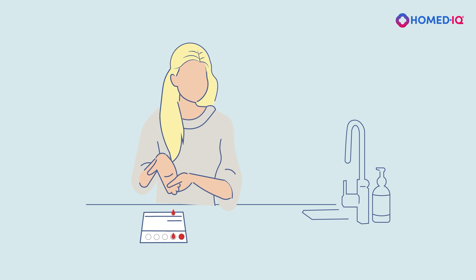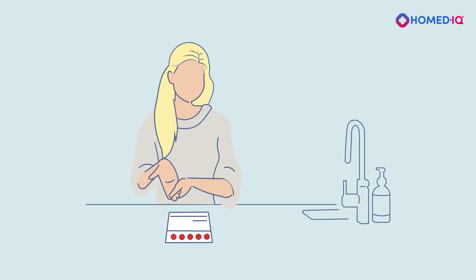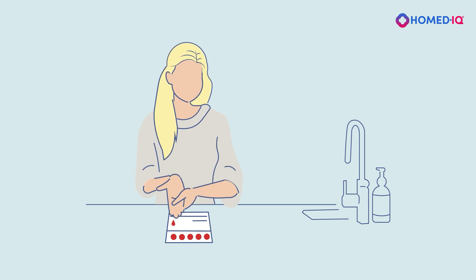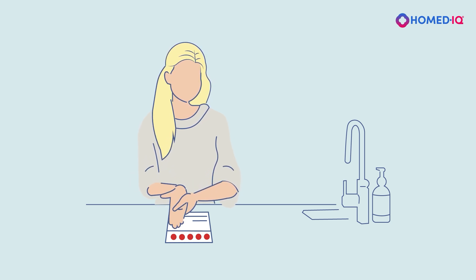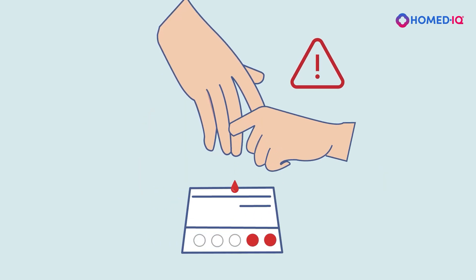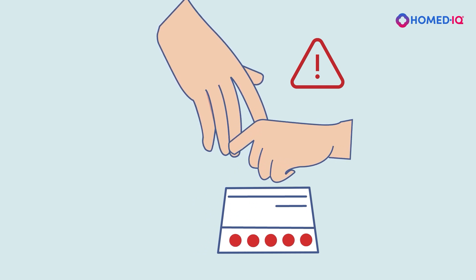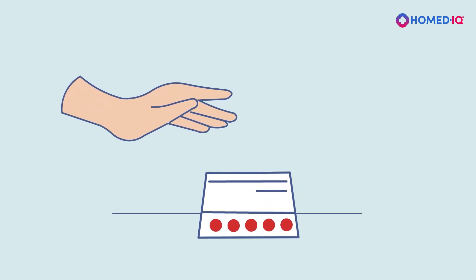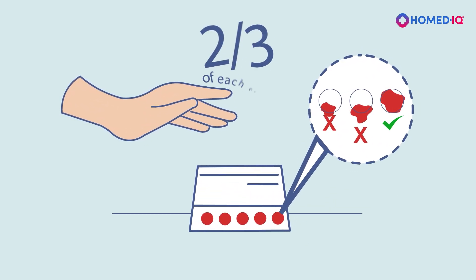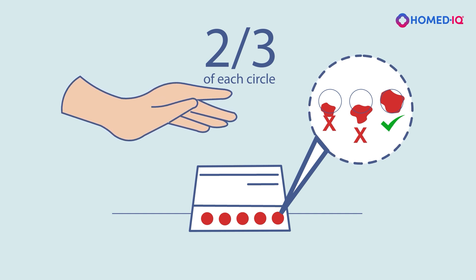Stand up and keep your hand below your waist to increase blood flow. Gently massage your finger from the palm towards the fingertip. Hold your finger above the blood collection card and let the blood drops fall into the marked circles. If needed, you can gently bring the blood droplet into contact with the collection card without touching the card with your finger. Avoid applying too much pressure to your fingertip or pressing your finger against the card, as this can damage the blood cells and cause the sample to become unusable. Completely fill all 5 circles up to the edges — at least two-thirds of each circle must be filled, as this is the minimum amount of blood the laboratory needs.